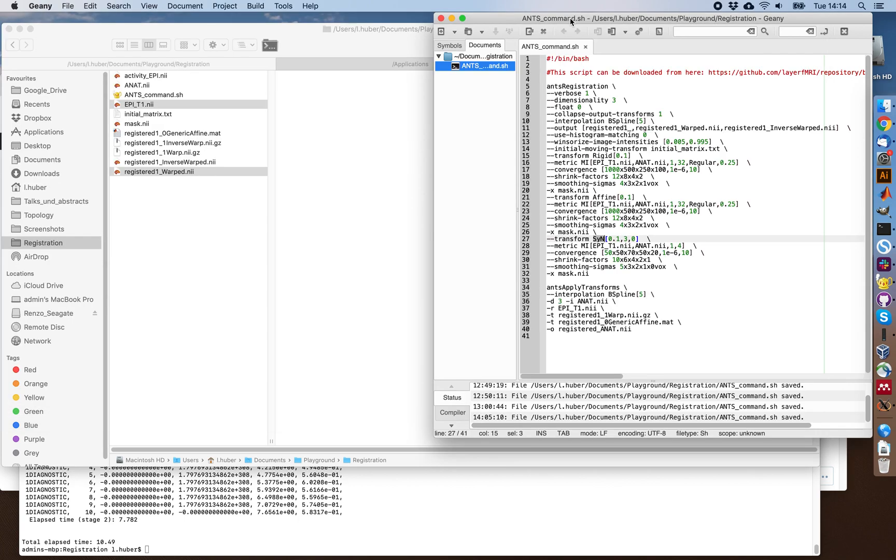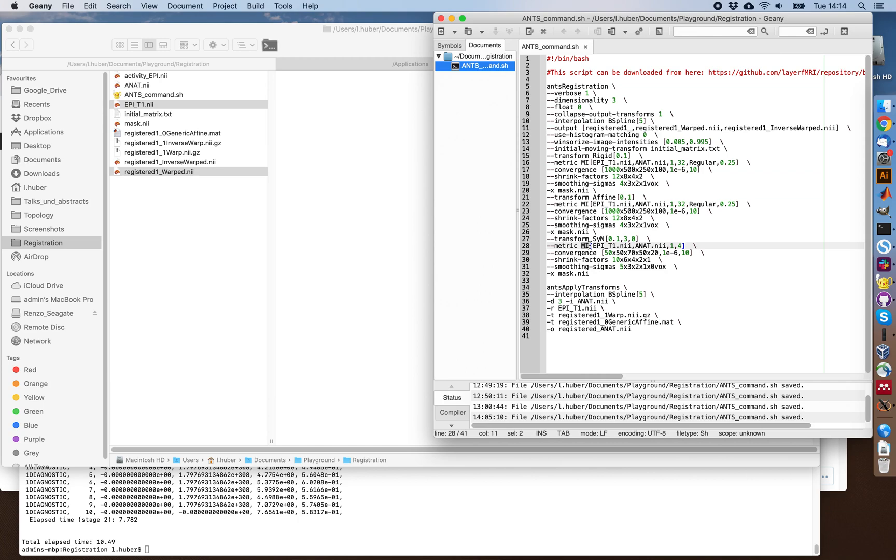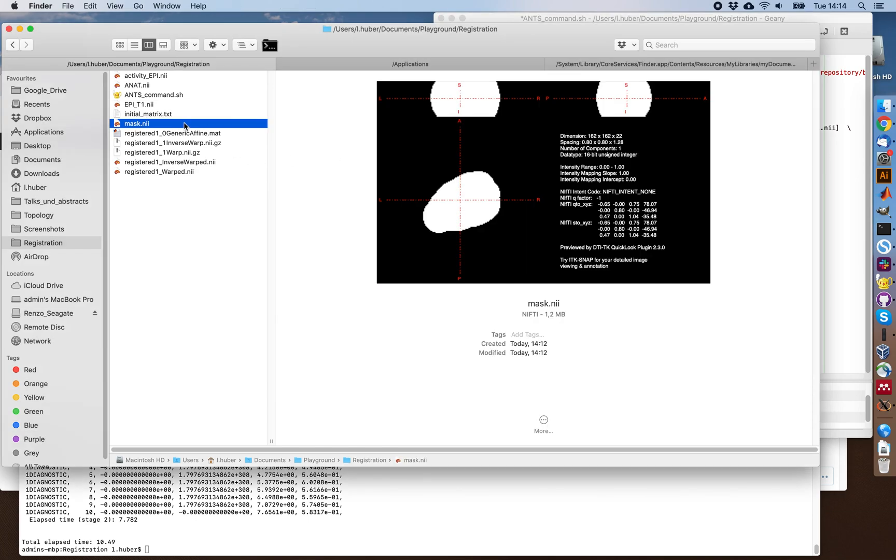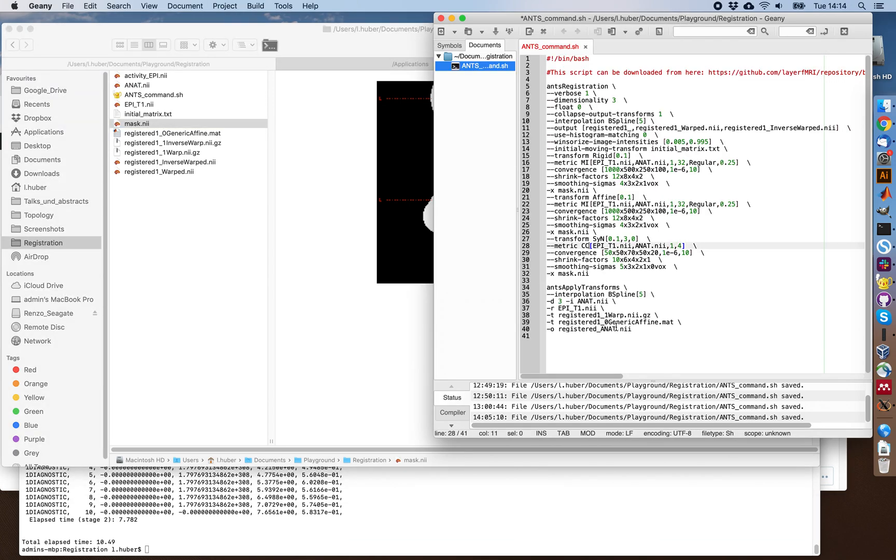If this does not work, you can always start playing around with these parameters. Parameters that I found helpful to play around with is, for example, the metric and the cost function of the registration. For example, changing the mutual information here to cross correlation. Or it can also help to modify the size of the mask that we drew here, make it bigger or smaller, and see if you're becoming more happy with the registration results.